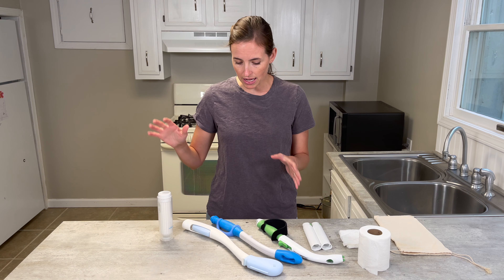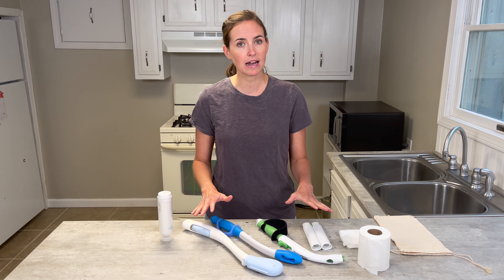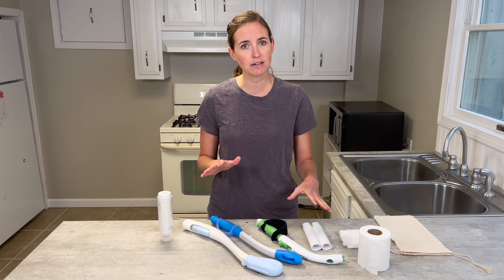I have four options that I'm going to discuss today. They all have slightly different features.